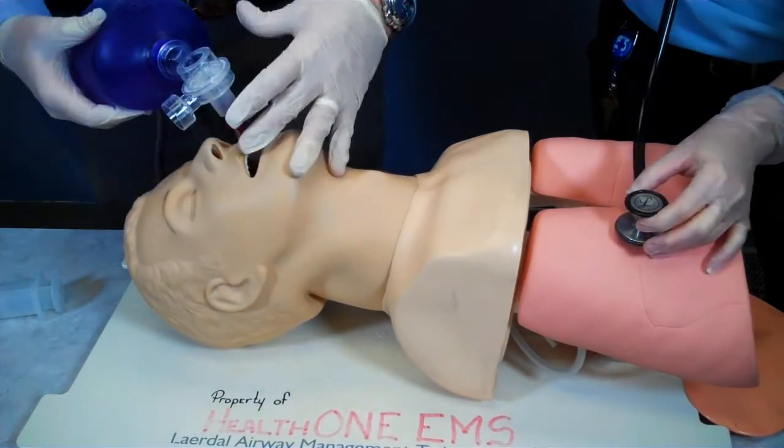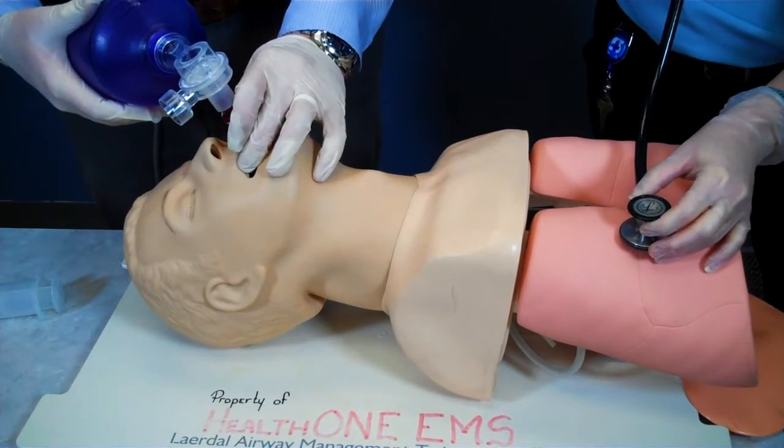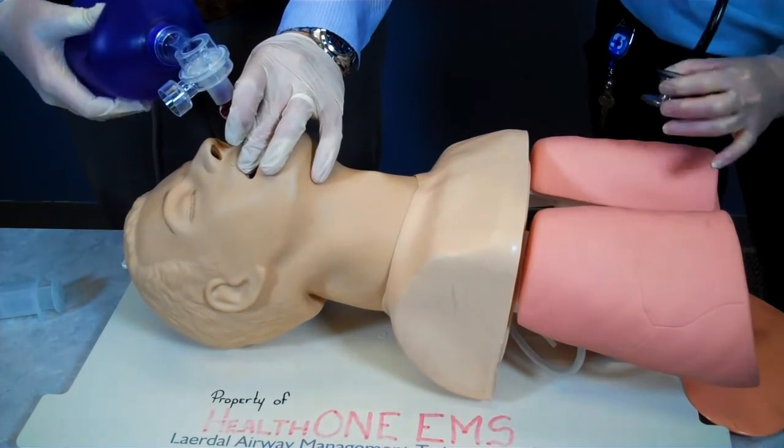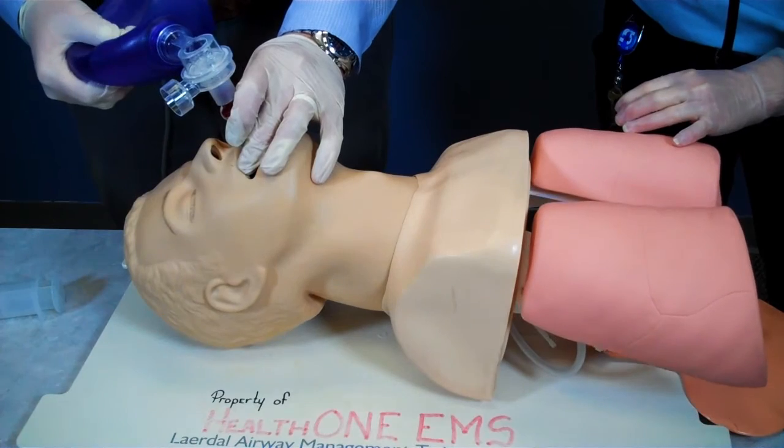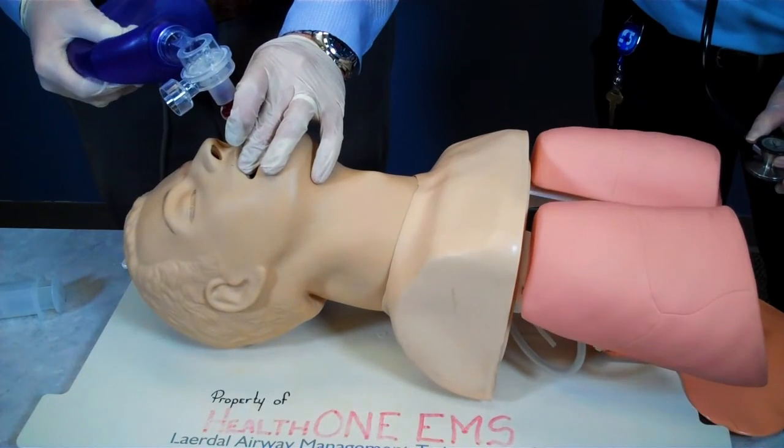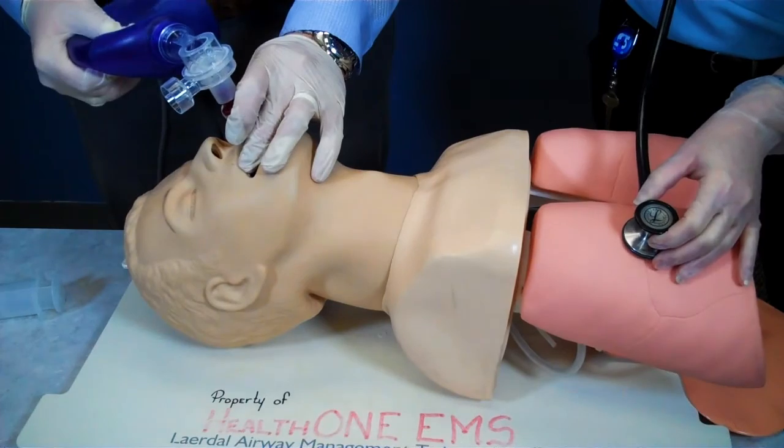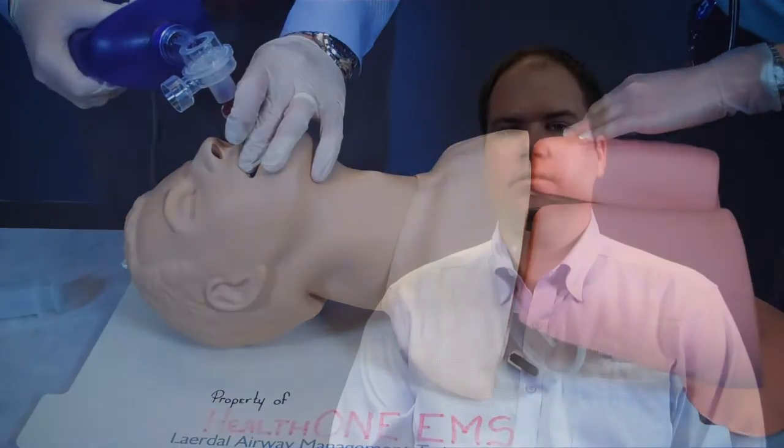I now take the BVM from my assistant and attach it to the end of the airway. I ventilate the patient with enough volume to see chest rise. I confirm placement of the airway by auscultation over the epigastrum and the presence of bilateral lung sounds.